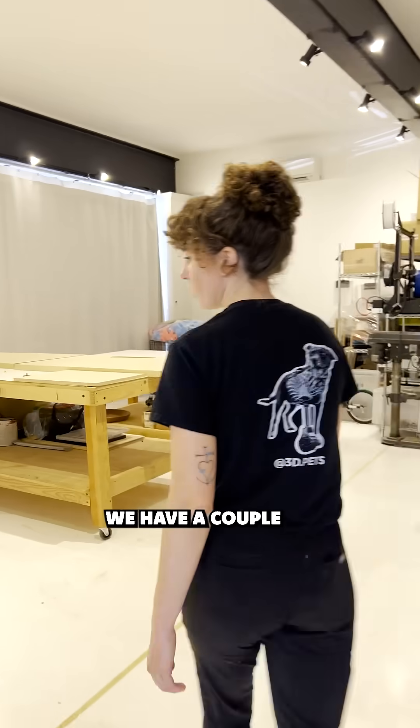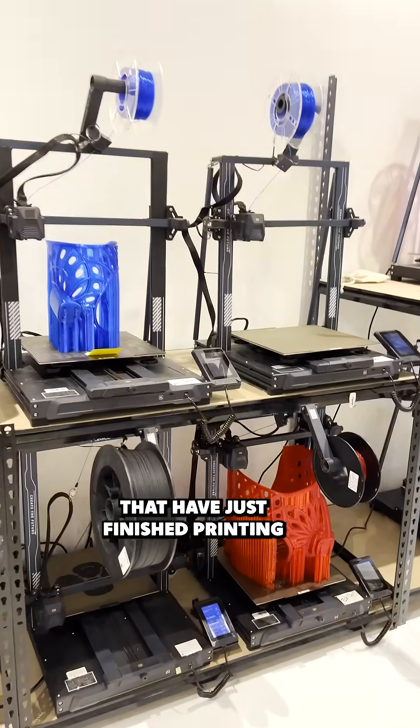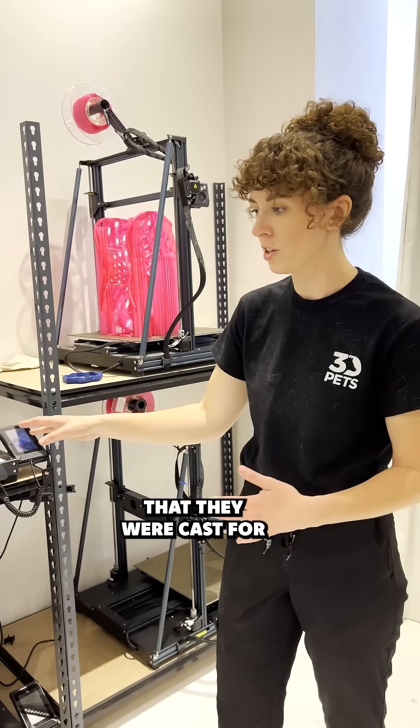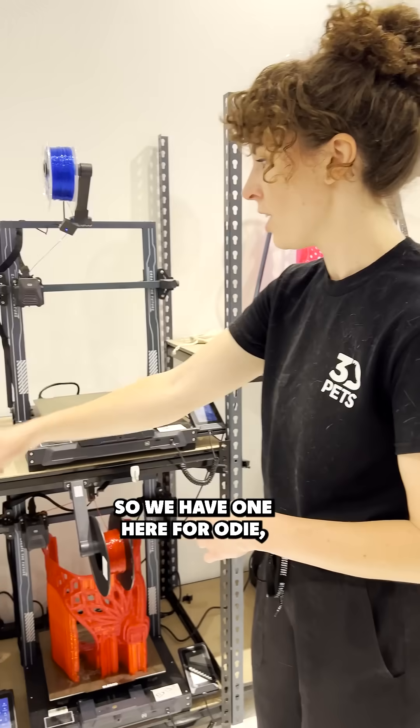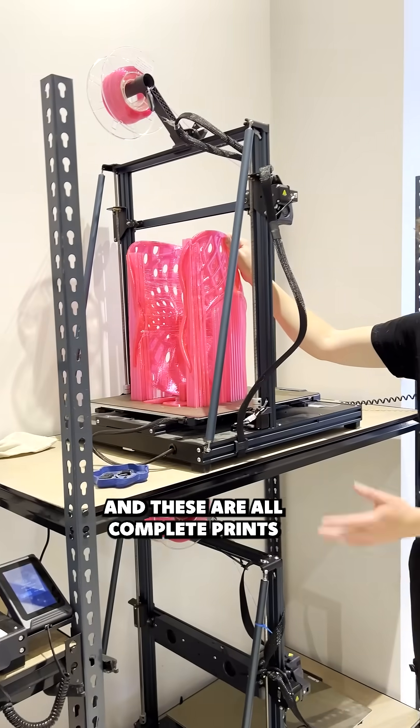You can see we have a couple of our custom prosthetics that have just finished printing. Each of these devices is completely custom to the animal that they were cast for. We have one here for Odie, Willow, Elvis, and Melody, and these are all complete prints.